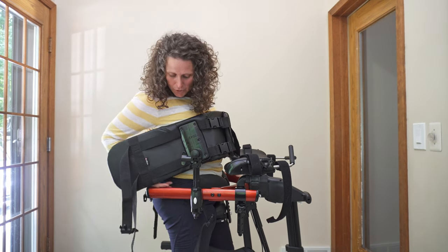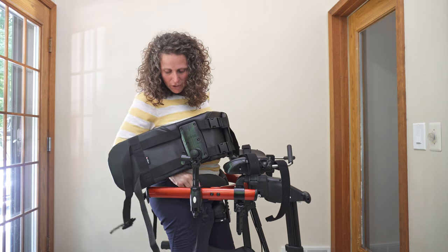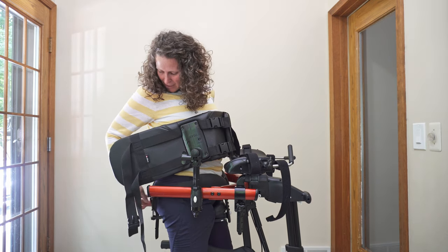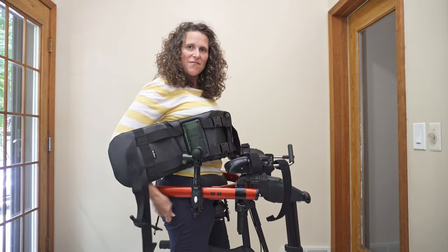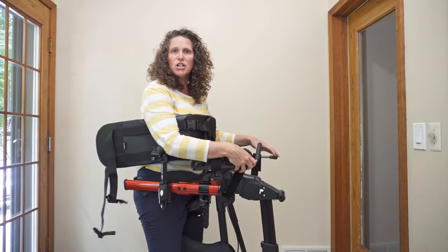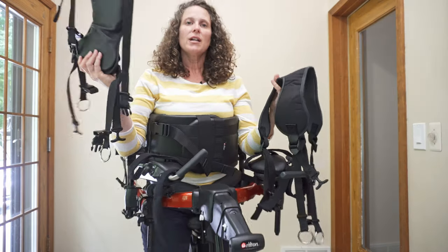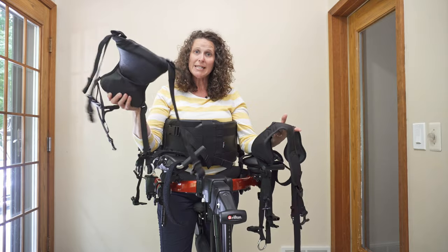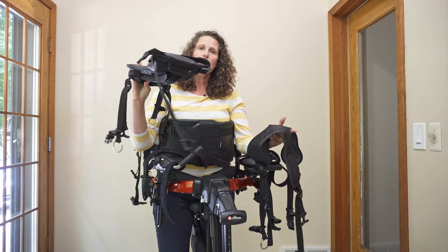I'm going to go ahead and strap that buckle on. Once you have this foundation position, it's a lot easier to make adjustments to the chest. You can also be using the pelvic support and the hip position instead of the MPS.